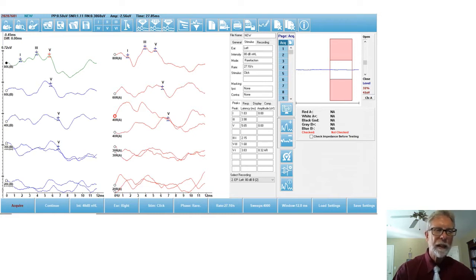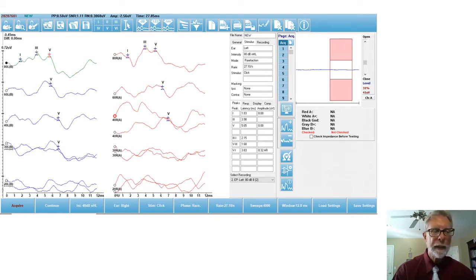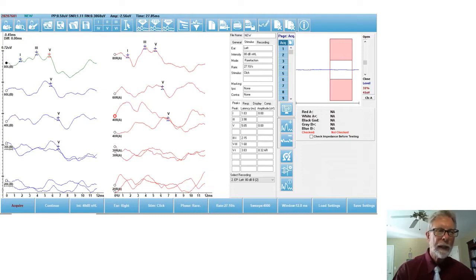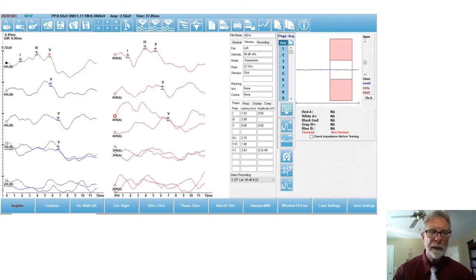And as you can see, I was able to do an ABR here, latency intensity function. And as you can see, I did both left and right ear, and I started at 80, and then 60, 40, 20, 30, went down like that.